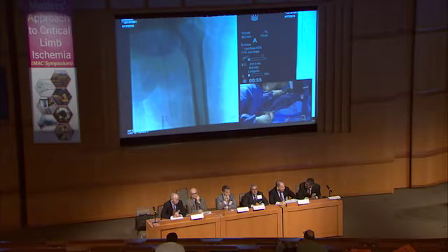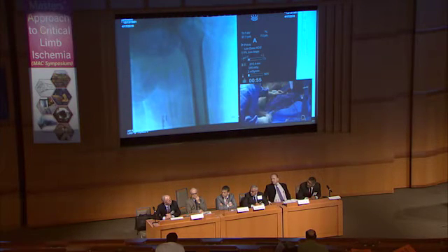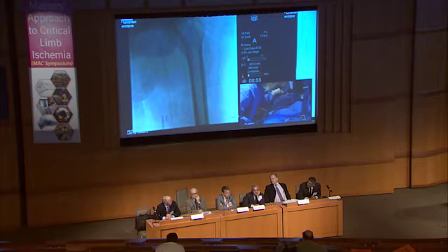I see. And I think the answer will be, once the stent grafts are placed and a shot of the profunda is performed, if we see continued fistulations from the profunda, that'll be the answer. I see. And then I would think that may need to be embolized, in addition to the covered stents right now? Yes. Okay. I think if you place a covered stent here and you still have a lot of arteriovenous malformation or AV fistula, then you're going to have preferential flow away from the SFA and be more likely to thrombose the stent. So we really want to deal with that.